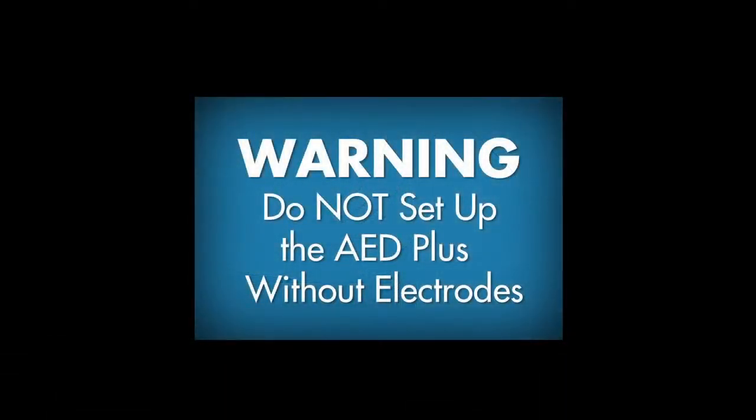If you don't have any electrode pads at this time, do not go through the setup process shown in this video. Doing so will cause your AED Plus to fail the self-test.